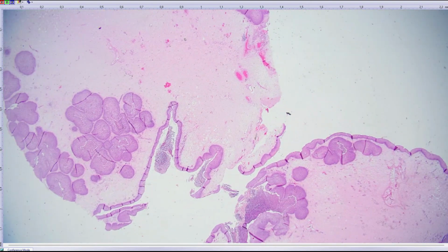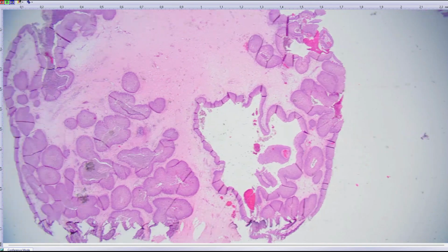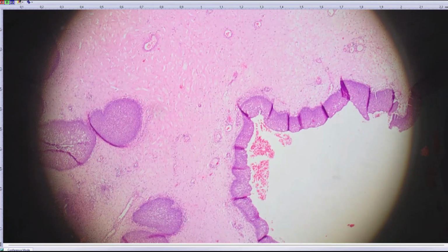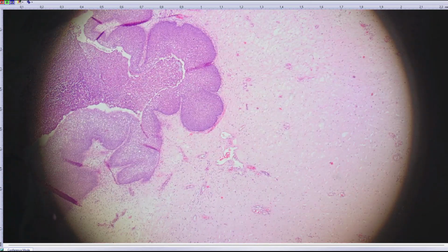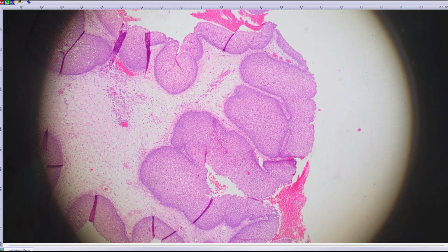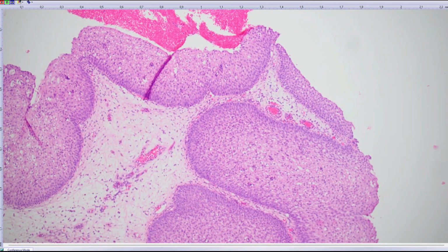It is this one. There is nothing difficult in it, and it's called inverted type of papilloma. Some still call it Schneiderian papilloma. Most of these lesions are EGFR mutated, and around 5% of these show malignancy. It is the type of papilloma that is most often malignant.